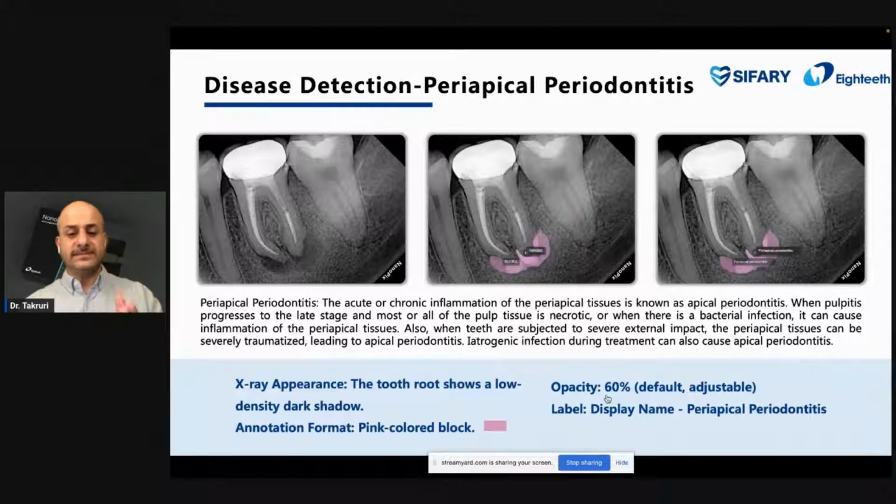So this service, this option, is an online option. So if you are a NanoPix user, if you don't have internet, you will not benefit from this software. So you have to connect your device to the internet. Otherwise, you can't use it. So it's not an offline service, it's an online service. Your device must be connected to the internet.